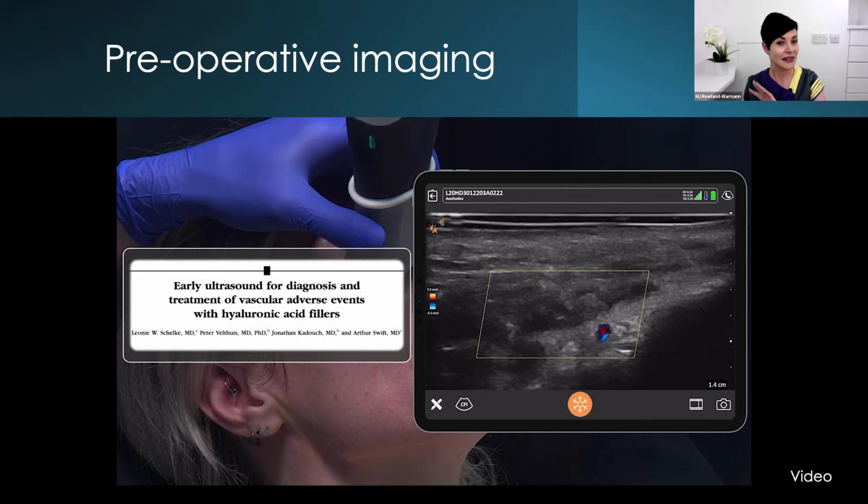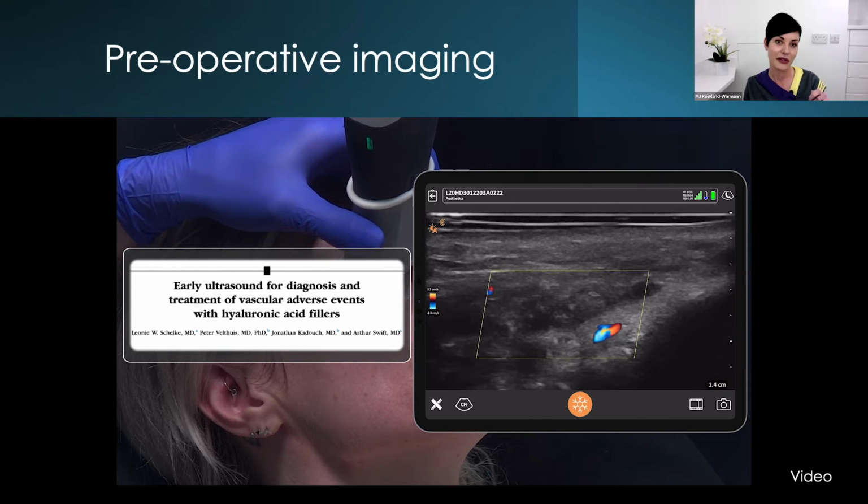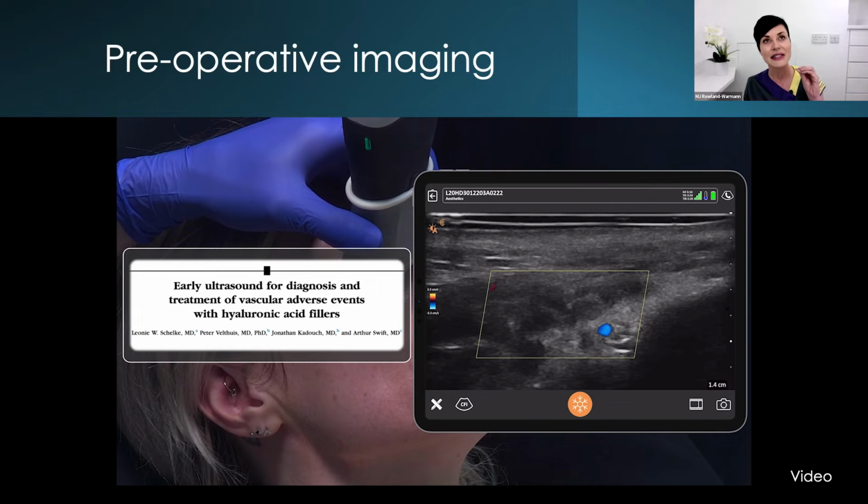Where filler is placed next to vessels, there will be inevitably a vascular response. And this response causes the symptoms of edema like in our patient. So filler next to vessels causes hypervascularity and edema. So what we see clinically is swelling, even if the filler appears to be in the right plane underneath the muscle. And this might be further exacerbated by the type of filler that's been used. Filler which is too hygroscopic can cause additional pressure and swelling, compounding this problem.